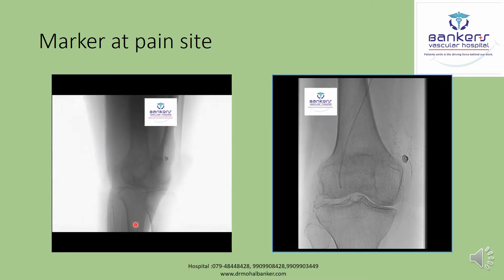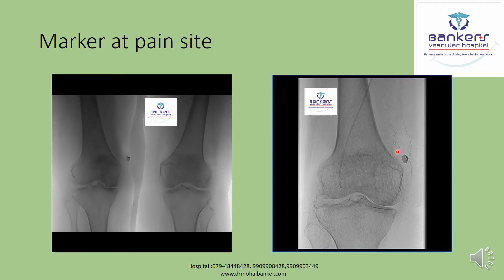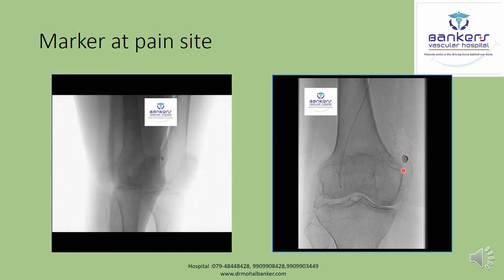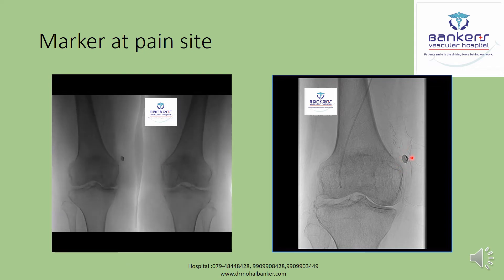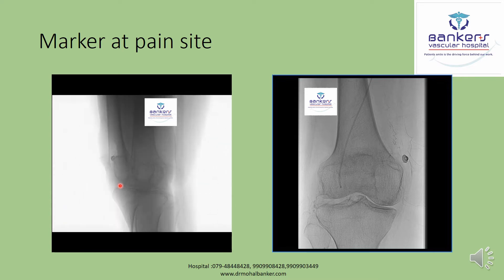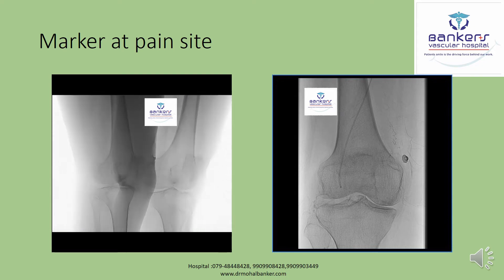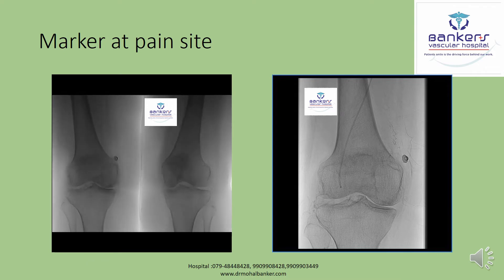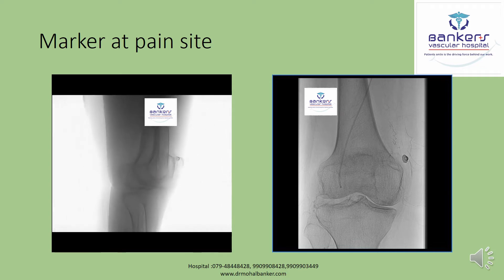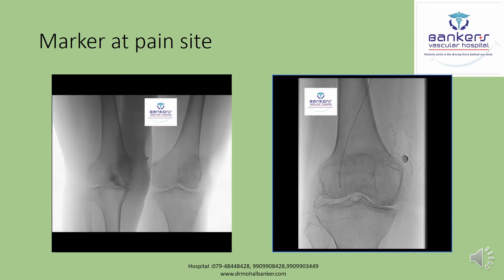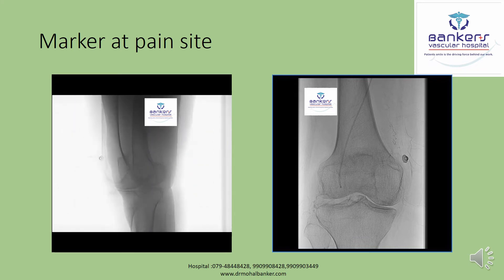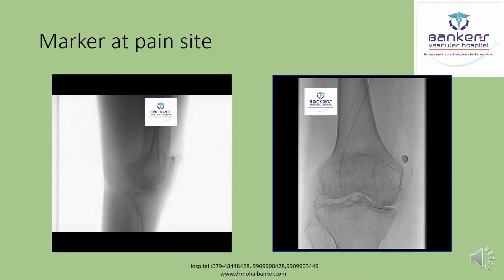In this first case, the patient has pain over a specific region, so we have placed a marker over that site. After placing the marker we perform a cone beam CT. When doing the angiography, we selectively cannulate the genicular artery and then perform a cone beam CT scan to determine whether blood supply from that genicular artery reaches the pain site or not.